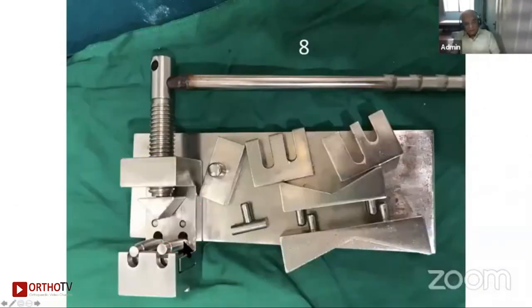Now here is Dr. Jawar Jethwa. He has made this plate bender, and these are all the devices for the plate bender. It is again Indian made by Jawar. This plate bender can be used in many ways, and I have been able to bend even the thickest of plates.